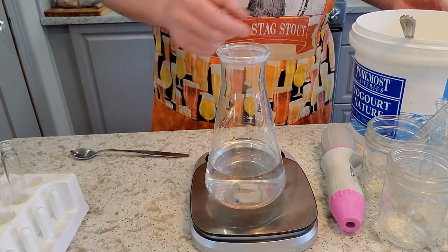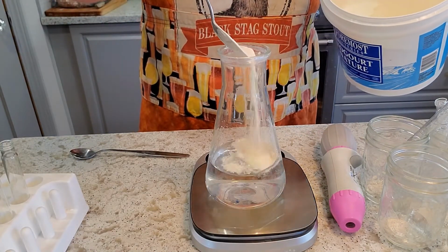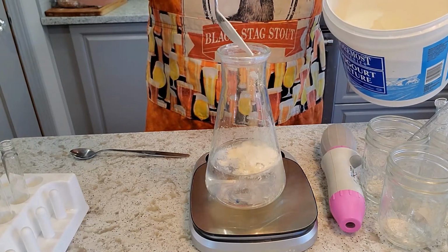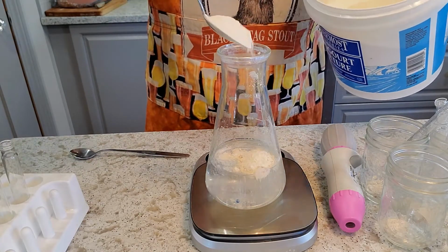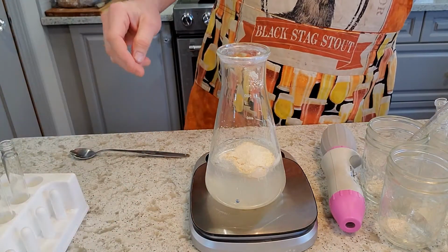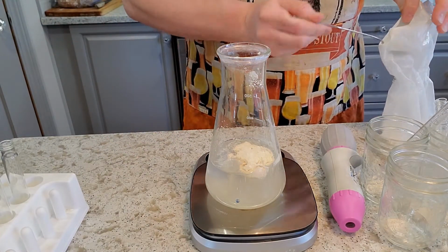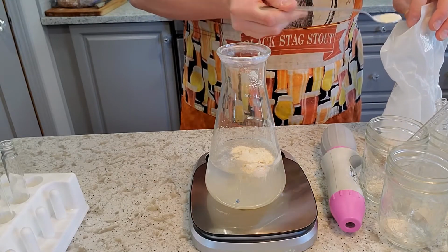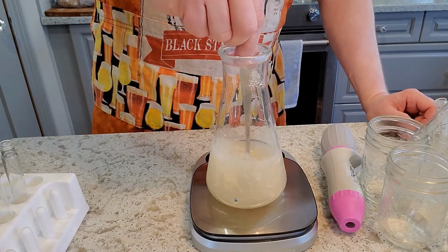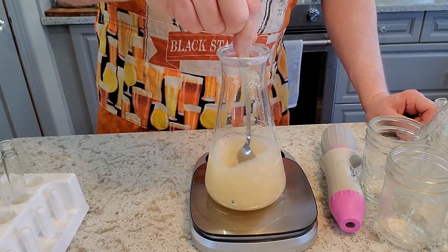So I've got 250 mils of that filtered water in there, and I'm going to be adding 13.64, right around that, grams worth of this dried malt extract. There. Perfect. I'm also going to put in just a little bit, this will be somewhere right around a quarter teaspoon or so of some yeast nutrient, just because obviously it's imperative that we have lots of nice nutrients going on here in that initial growth phase of the yeast.